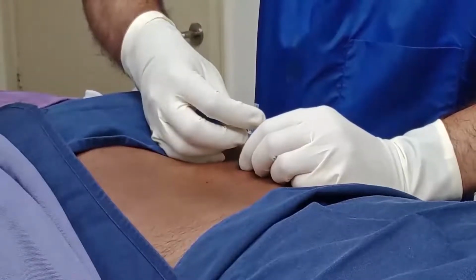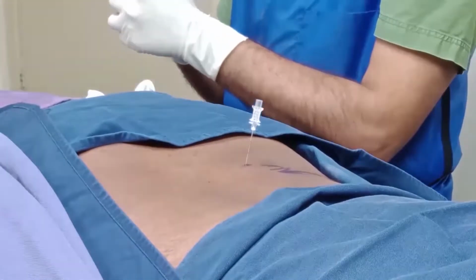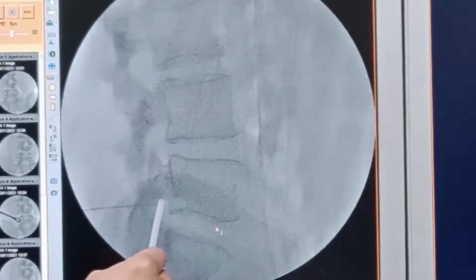The needle is advanced, taking the shots in between. The needle tip is in the intervertebral foramen now. So this is the top part of the intervertebral foramen, which is safer from any artery or nerve which could be over there. So this is the safer quadrant of the intervertebral foramen for the 1/3 of the intervertebral foramen.